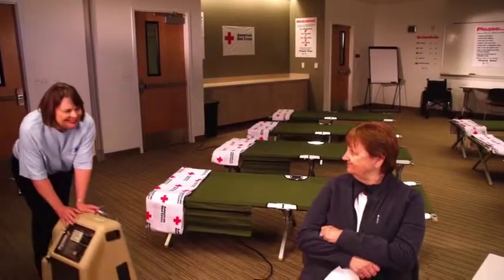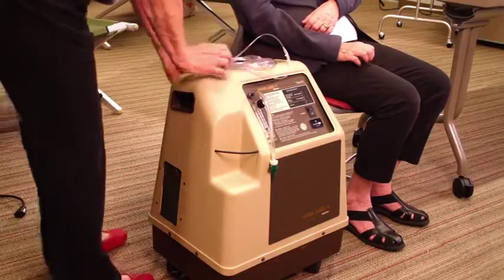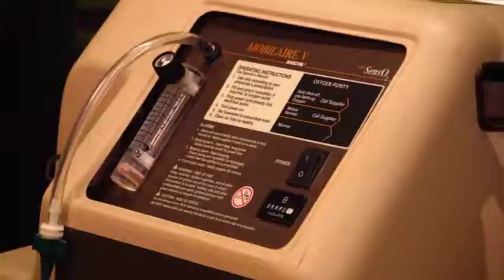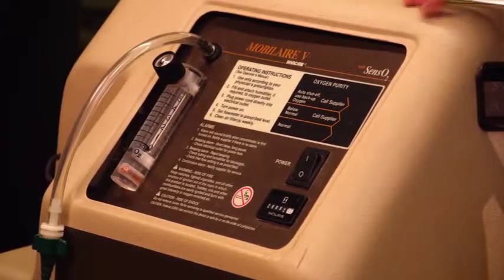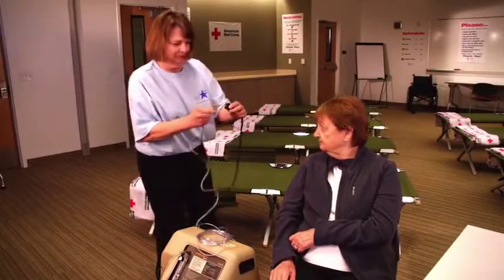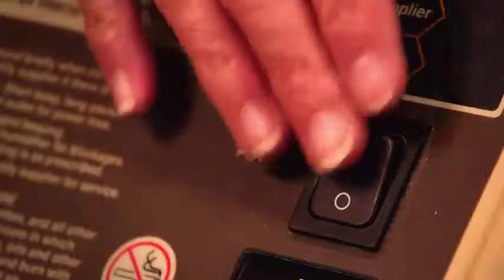An oxygen concentrator concentrates the amount of oxygen in the air from 21% to about 89%. This is a home concentrator. The home model needs a source of electricity to power it. The first step in using a home concentrator is to plug it in and power it on.